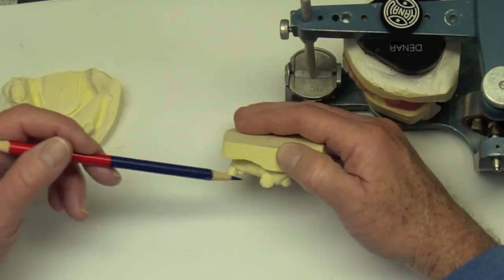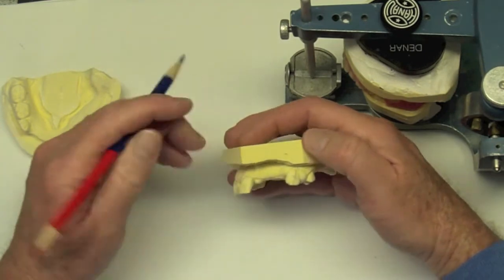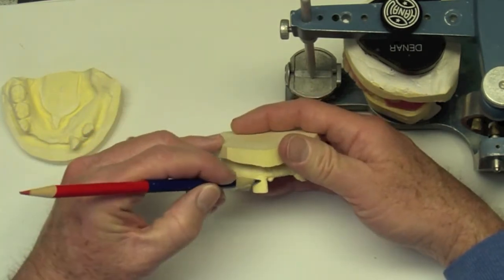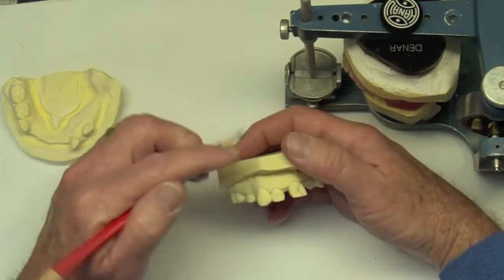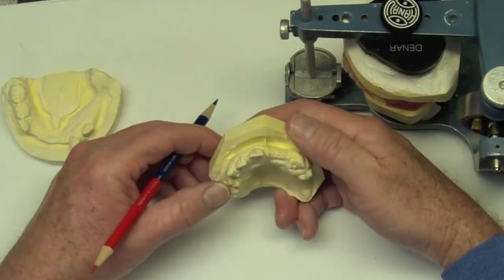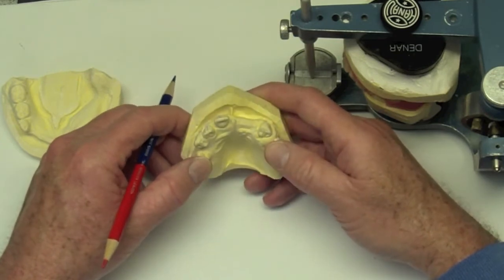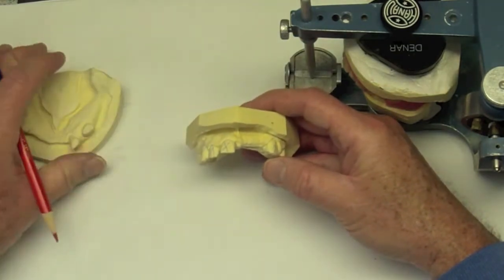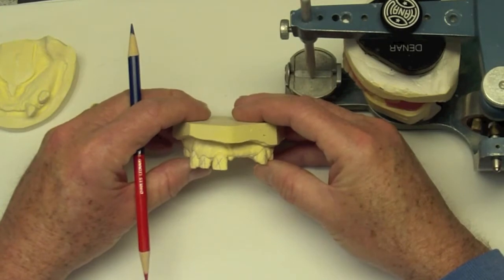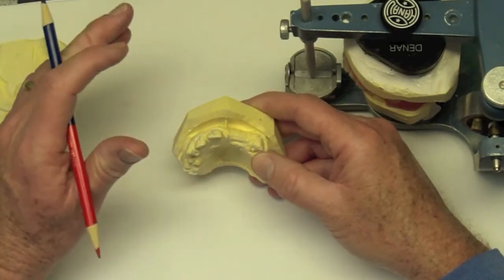The plan is to extract this tooth, this tooth, this tooth, and this tooth. We're taking out the canine, we still have a central incisor, a lateral, and the other canine. And we're going to go ahead and retain these three teeth and use them as retention for what's going to be an immediate interim removable partial denture to allow some time for healing.